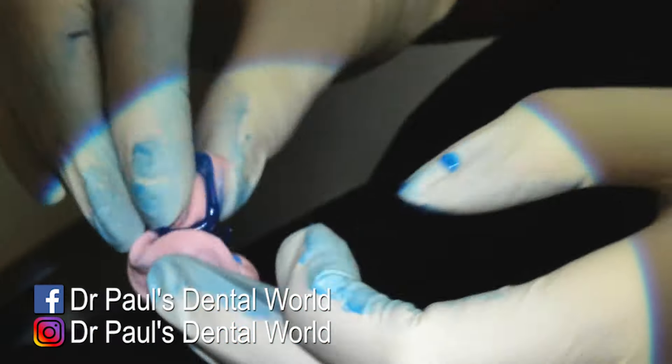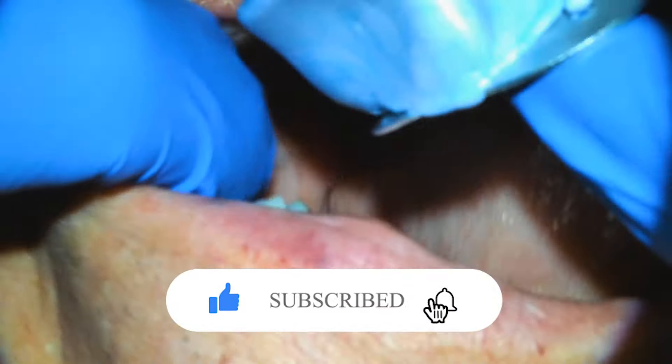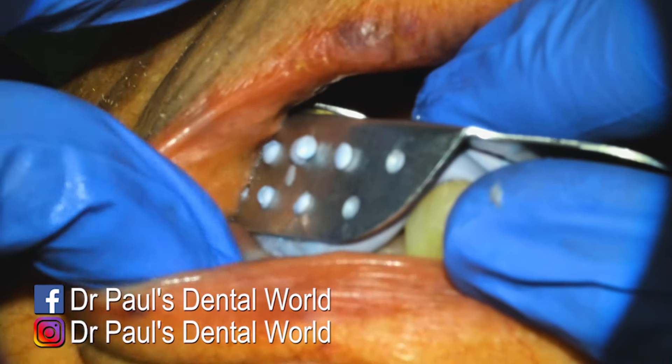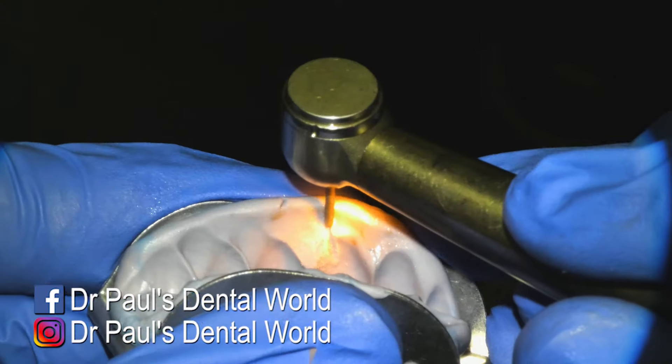We're going to be doing a crown for this tooth. So as I'm finishing my local anesthetic, my assistant starts mixing the putty. I load it into my tray and then I put it over the top of the tooth, making sure it goes over at least one tooth either side. Then I feel to make sure that it's set and I take it out.